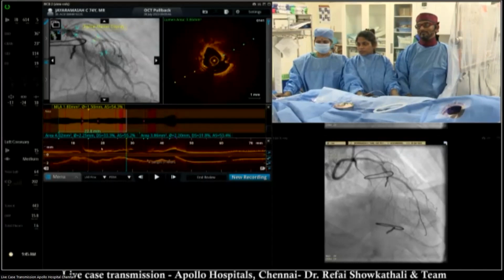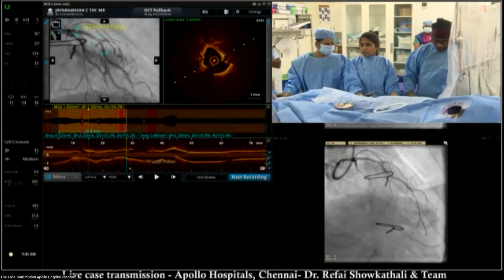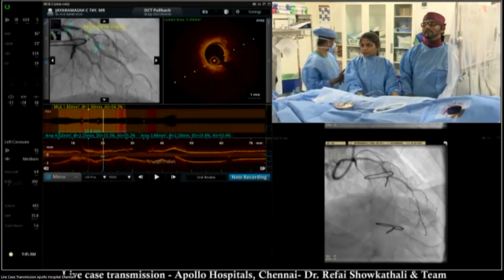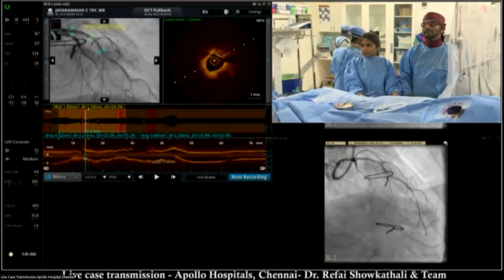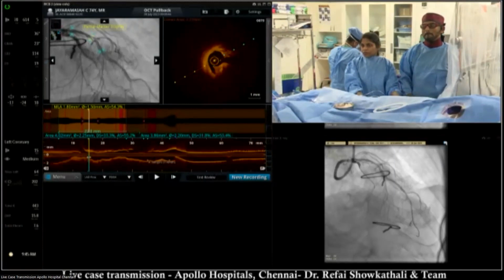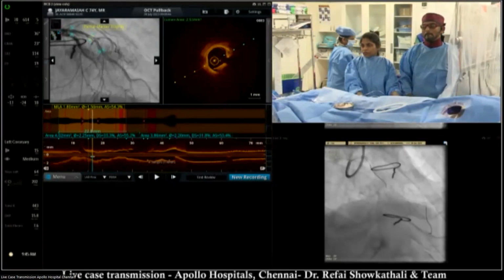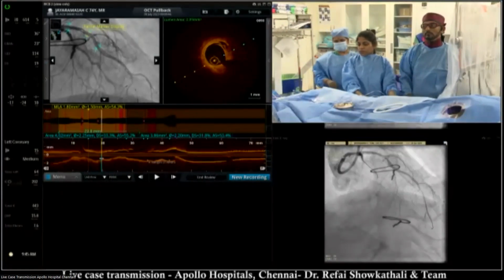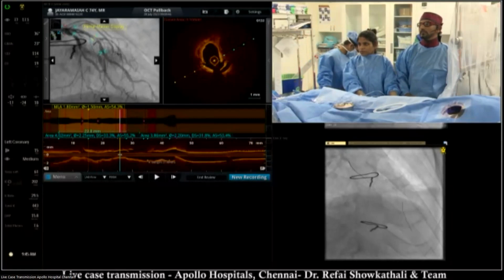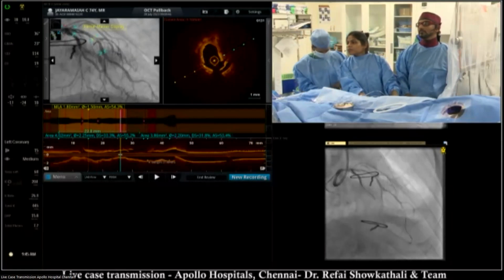Of course not. So Ramesh and Pratap, it's me here, Ashish. So let me just tell you, by using a 2.5 stent, you're not committing to a 2.5 diameter. You have the luxury of going up with an NC balloon of whatever size you want, especially if you're using stents that allow you to do that, like the current generation of 3rd and 4th generation DES, especially if you use Synergy or Onyx or whatever stent you use.